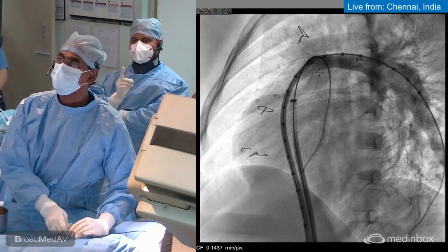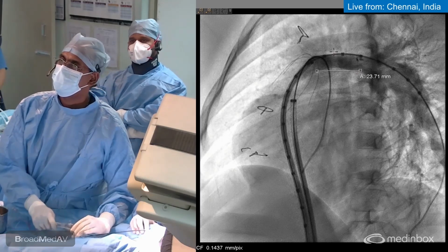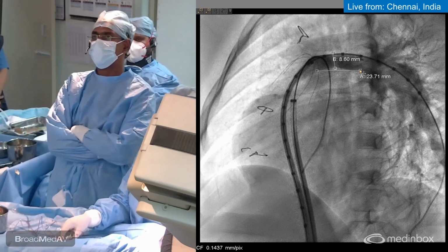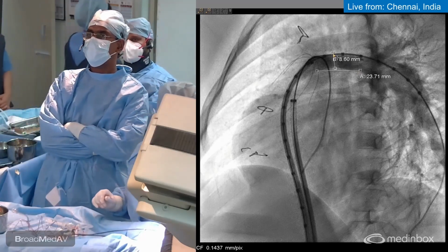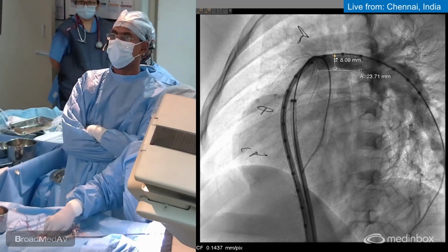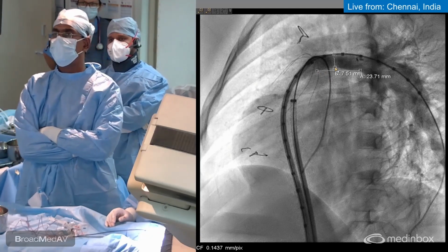So what are the kinds of stents that are suitable for these branch PAs? Well, no, it may not be 8.6. I think it's a little over. We have to reduce it. Yeah, correct. The stent is sort of hugging the lower border, also needs to be taken inside.